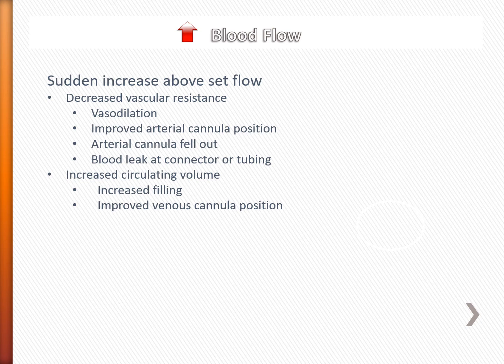It also can be increased circulating volume. So maybe you've just given the patient a bolus of fluids, or they're getting a lot of medications or have a lot of IV drips. So they have increased filling. The improved venous cannula position as well can cause this.